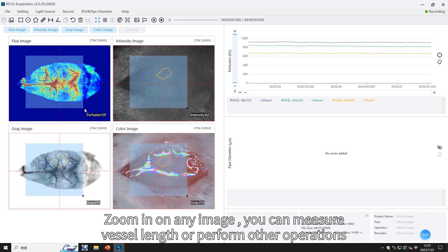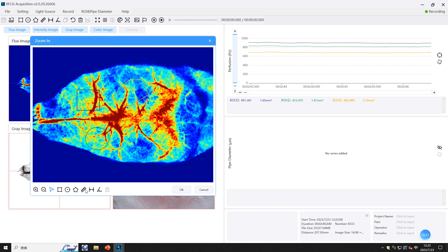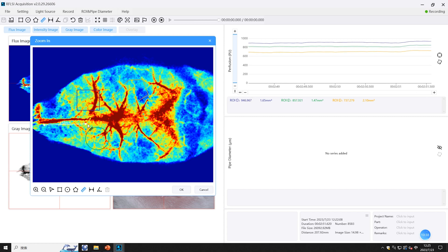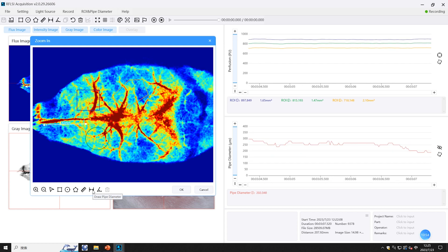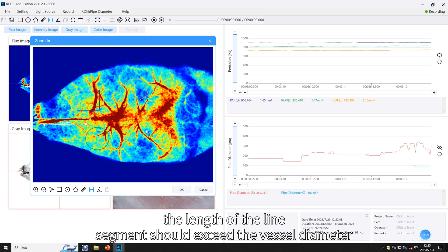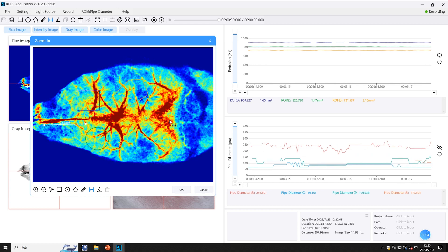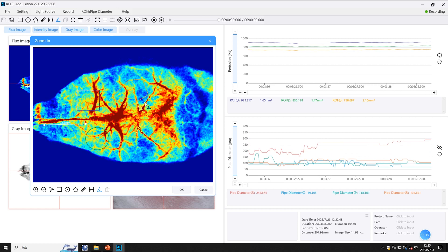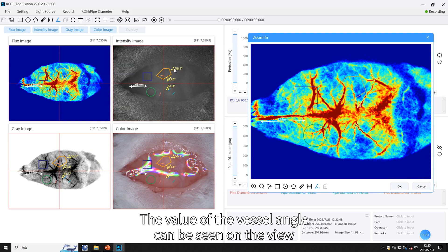Zooming in on any image allows you to measure vessel length or perform other operations. When plotting vessel diameters, the length of the line segment should exceed the vessel diameter. The value of the vessel angle can be seen on the view.